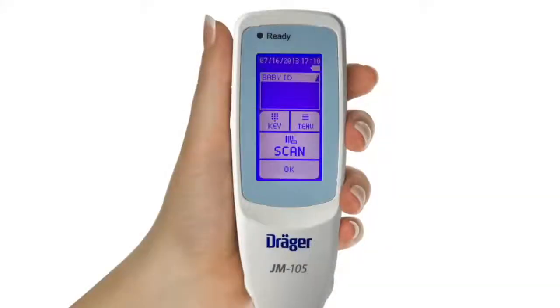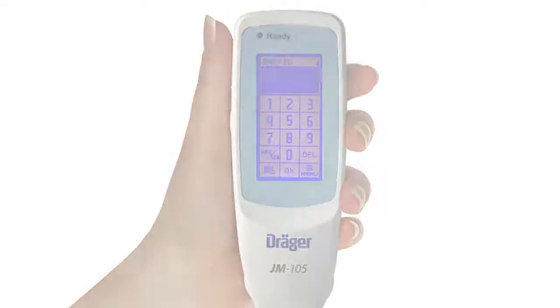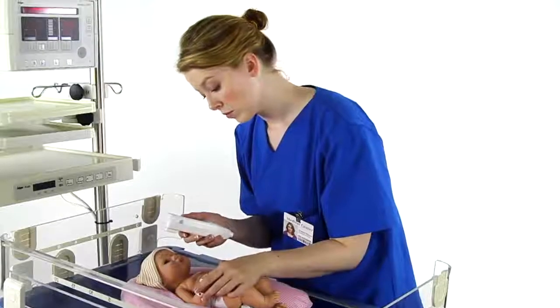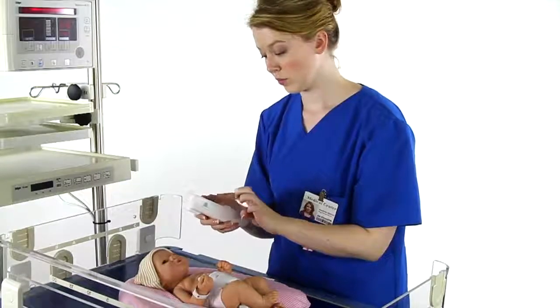You can also switch back and forth between barcode and keypad on the nurse or baby ID screen. For example, if the barcode on the baby's armband is unreadable and won't scan, you can enter the baby's name or medical record number manually.